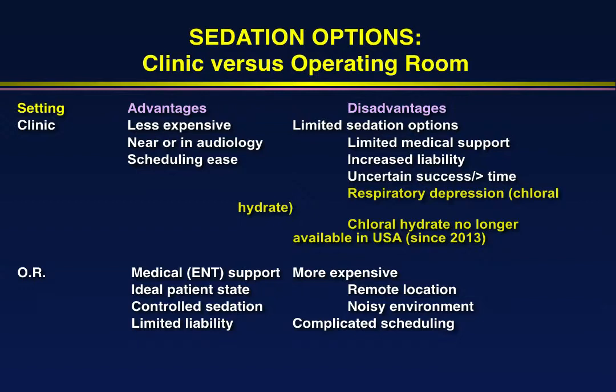It takes too long. There's a big emphasis on productivity in the United States, and we just can't wait around for a few hours for a child to wake up before going on to the next patient. So it's not available in the United States.